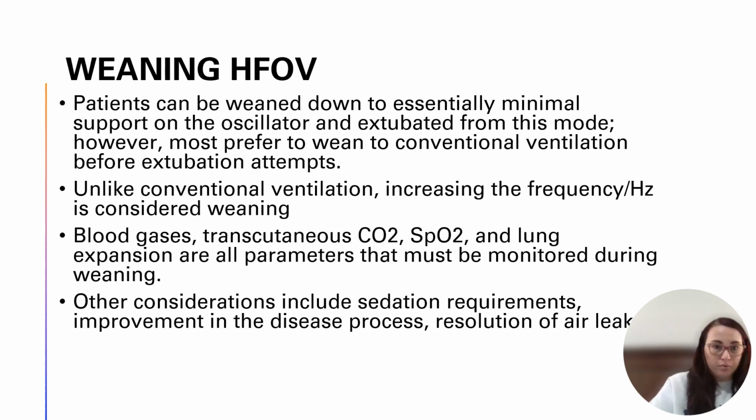And then you're going to monitor your blood gases, your TCOM, your SATs, your lung expansion, and just patient tolerance during weaning. Can they tolerate less sedation? Is the disease process that got us on the oscillator in the first place, has that resolved? Is their belly better? Are their lungs better? Is their x-ray better? Things like that. Can we manage secretions? What's your mean airway pressure? Are you still needing a high mean airway pressure? Is your mean airway pressure in the 20s, or are you down in the teens? These are all things to think about while you're weaning.